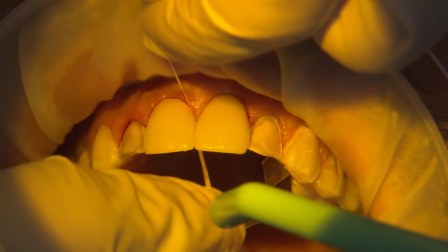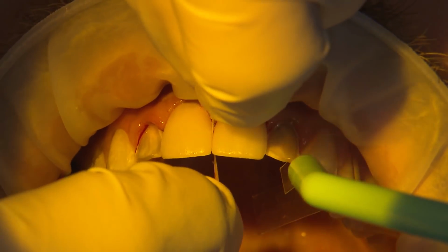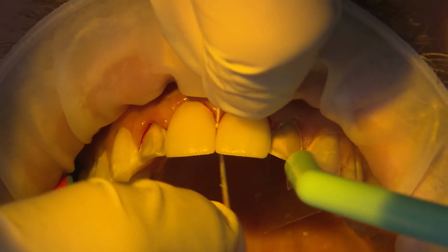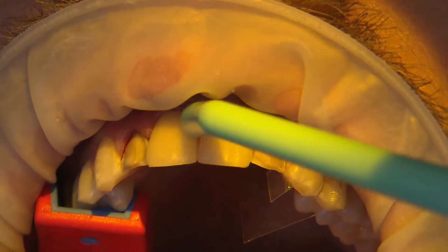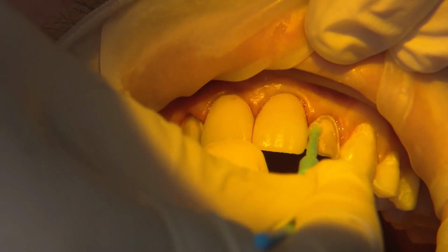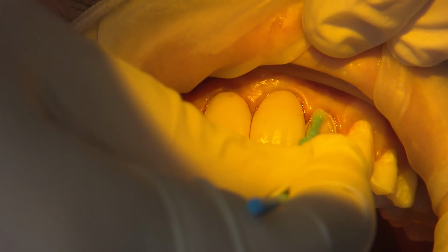Once the veneers are fully seated, we tack cure along the gingival margins to accelerate the cement to a gel state to aid with the removal. After most of the cement is removed along the gingival margins and lingual, we polymerize these areas more so they can help hold the veneers in place during the interproximal removal, which is usually the most challenging area. We repeat this same process on the laterals.